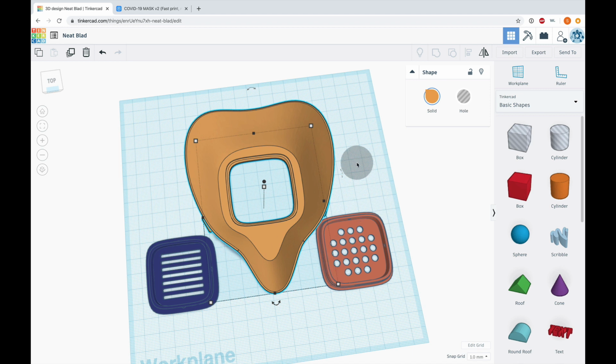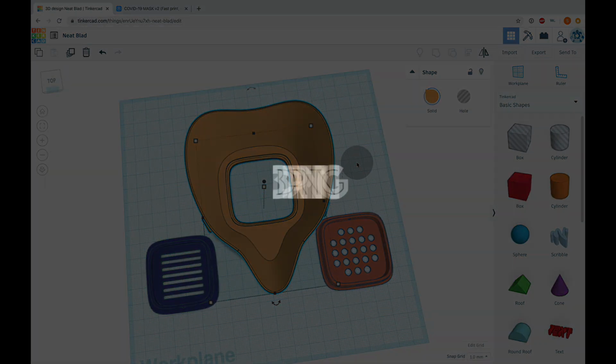The next step is for us to put this onto our 3D printing software and let our 3D printer do the job. All right, so we're going to send our 3D file onto the 3D printer, and I want you guys to check out this time lapse of my first print. Here we go.